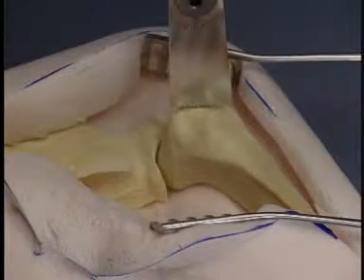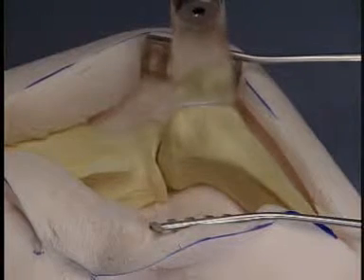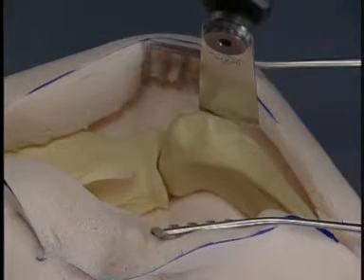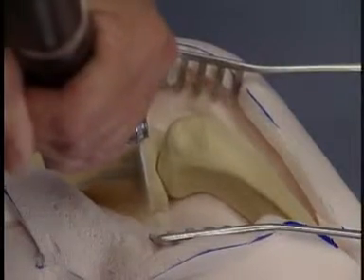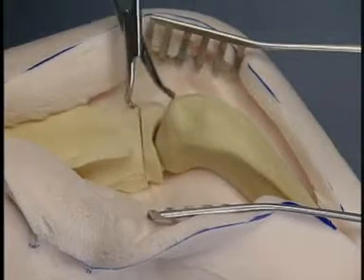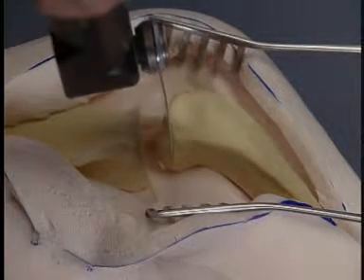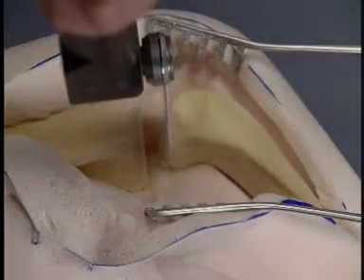First, the greater tubercle is resected to aid exposure and provide a flatter surface for the plate. Second, the articular portion of the scapula is resected perpendicular to its spine. And third, when the shoulder is flexed to the predetermined angle, a parallel ostectomy of the humeral head is made.